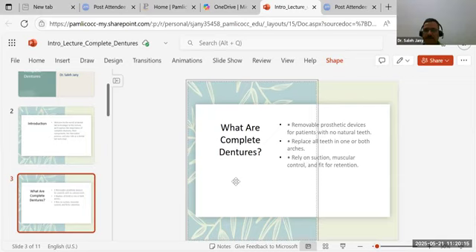So when you do a fixed complete denture, you have to remove the flange of the complete denture. Why? So the plastic caps, you said they still go over the canines? No, if you have implant and we make the denture fused on the implants there, and the denture is either fused to this implant through screws or through locator, it's fixed.